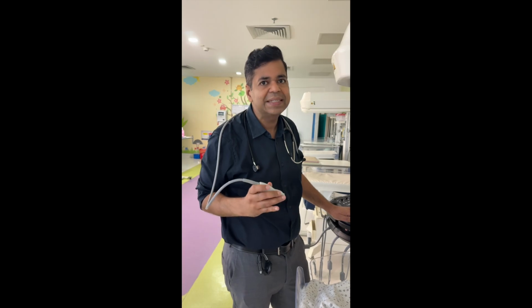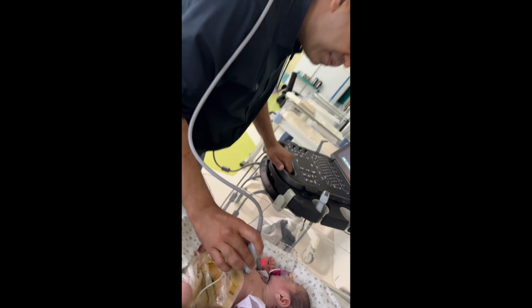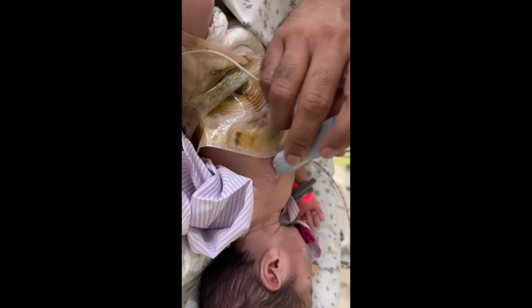Everybody. So today we are going to learn how to calculate the ejection fraction in the newborn. Ejection fraction is a parameter which is used to assess the systolic function of the heart. So first of all, we will acquire a good apical 4-chamber view.